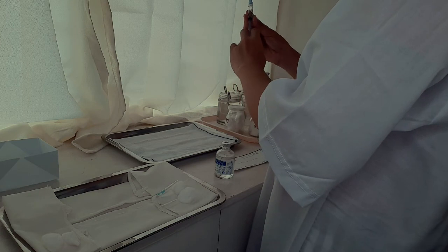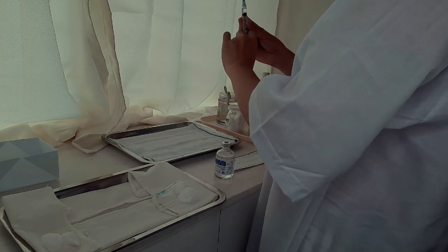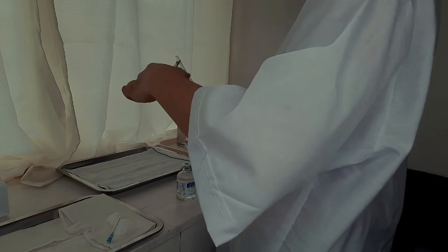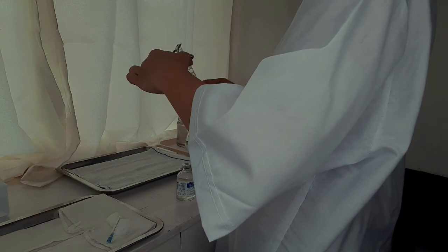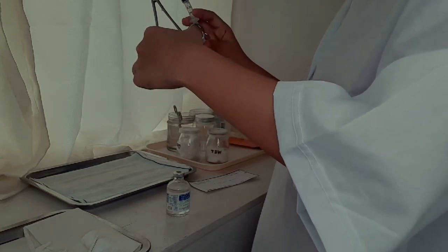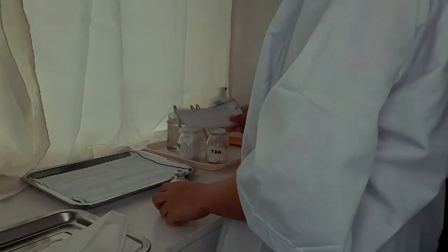And then pull the plunger down to change the needle. Do the third reading. Sterile water, sterile water.